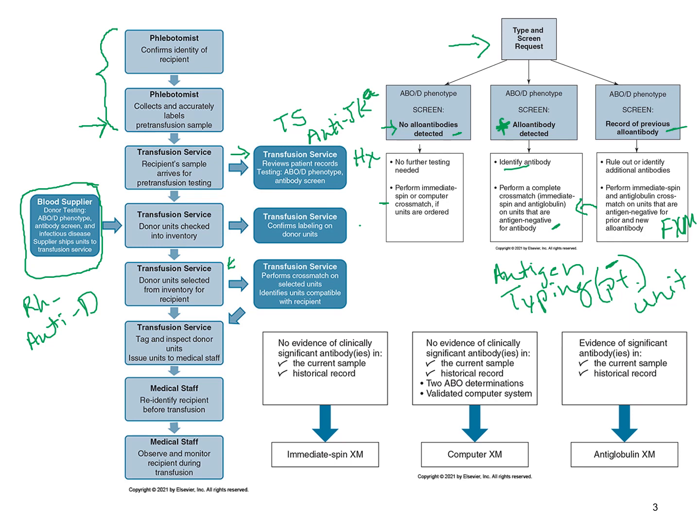And then once the nurse starts that transfusion, they have several checks that they have to do. It's usually 2 individuals involved, reading off the patient's bracelet as well as that unit to make sure that everything matches.